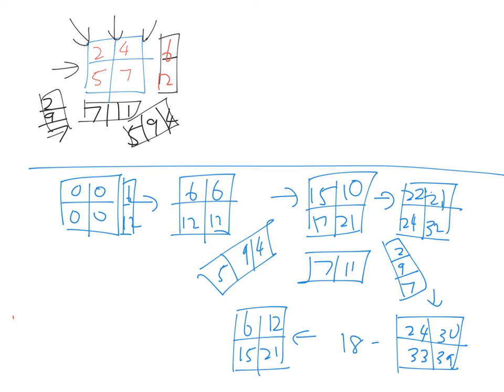Now the last step is just a formula. Don't have to worry how they got it. It's just a formula. They divide by 3 only. So you will get 2, 4, 5, 7. Which means to say, if originally I don't know what are these 4 numbers, I just total up these 4. I can work my way all the way and find back the numbers which are inside here. That's what it means by getting the image of one slice, just by finding the total in each direction.